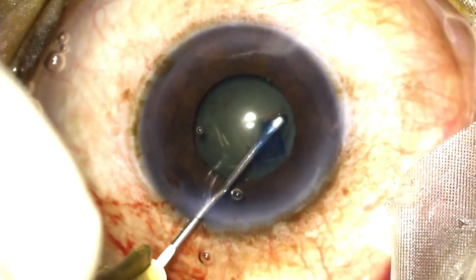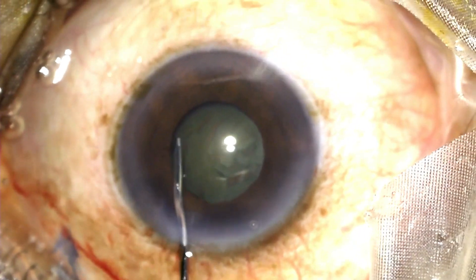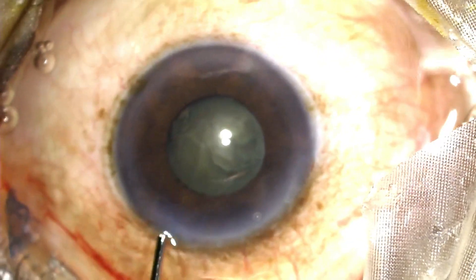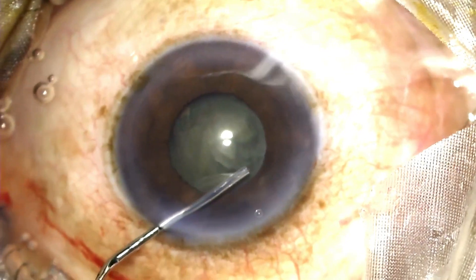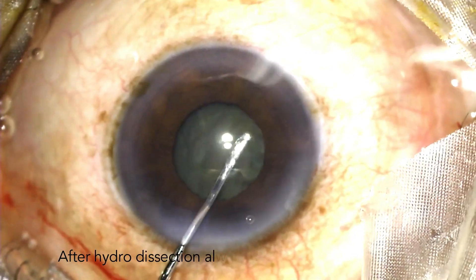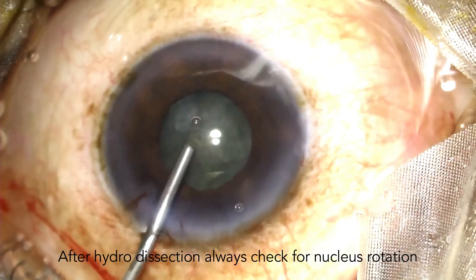Another important point to note is that the hydrodissection procedure becomes fairly blind — you cannot really see the wave go up to the equator and behind it. So you look for the visible wave in the visible part of the nucleus within the pupillary edge, as well as you look for a nuclear rise. And finally, you rotate the lens to confirm the completion of the hydrodissection.